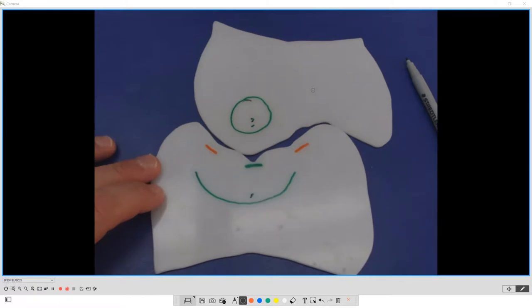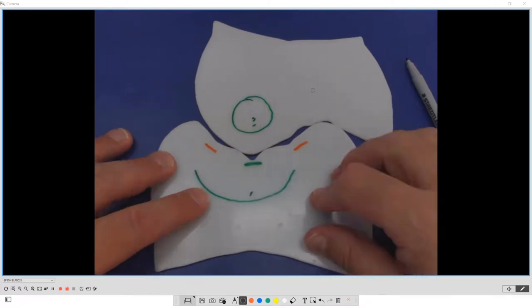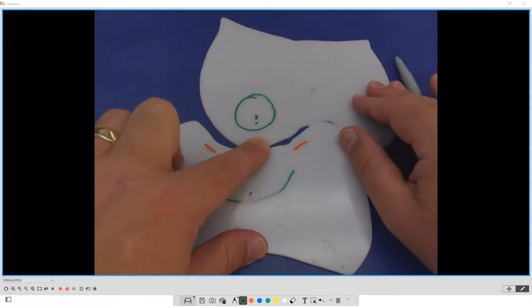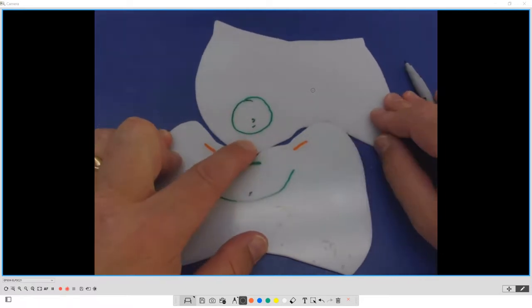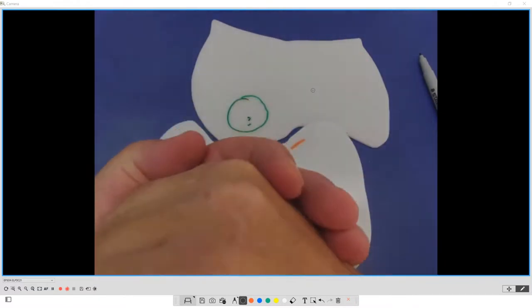What have I learned? My interpretation of 20 degree standard teeth that I was taught in school and raised on in the beginning part of my career is that it had to be full touch and then full working and balancing this way without regard to a chew cycle. What happens is this is more milling, okay? Because you have to sit here and mill it, like they would say flour. It mills. This is crushing.